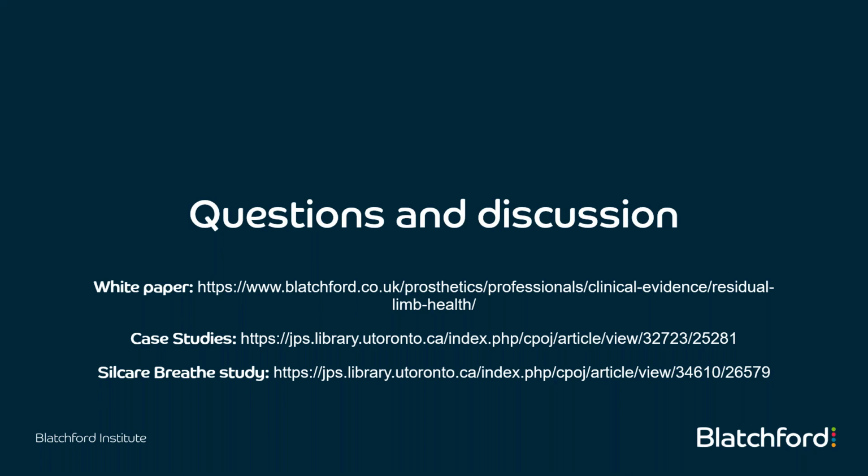Okay, thanks. Kate Pearce, another question about the Silcare Breathe: do you have to use a particular suspension sleeve with the Silcare Breathe? Yeah, thank you, Laura. You can use any suspension sleeve with the Silcare Breathe liners, just whatever is best for your patient. If you want to think about what type of vacuum you're going for, you could perhaps try the Viva sleeve that we get from Alps that has its own vacuum valve imprinted into the sleeve, or you can have one inbuilt into the socket. But anything you fancy really.